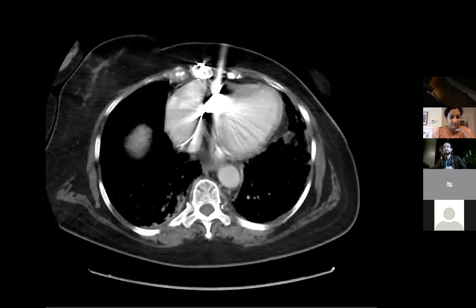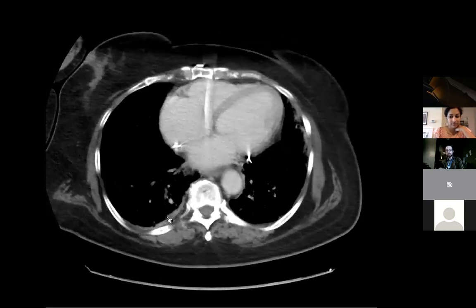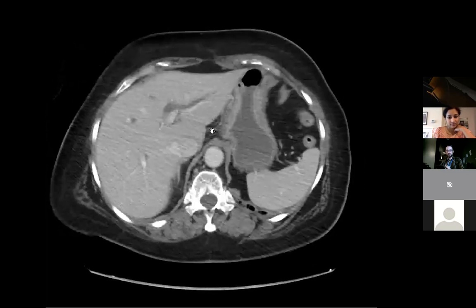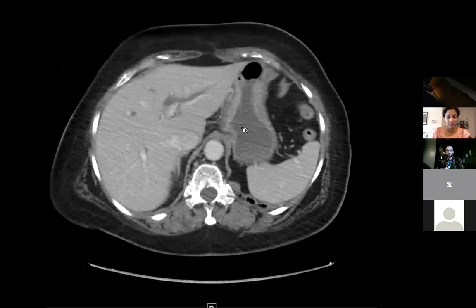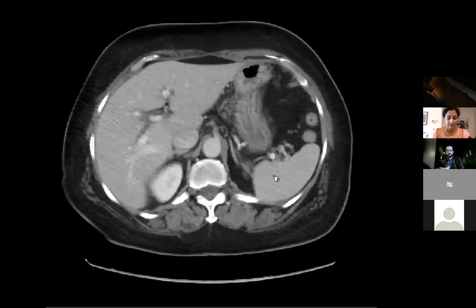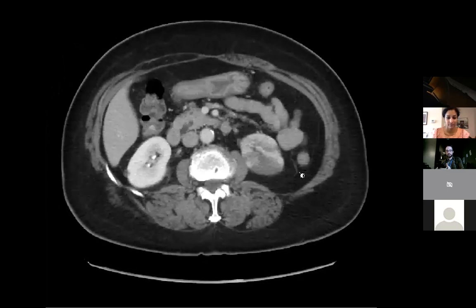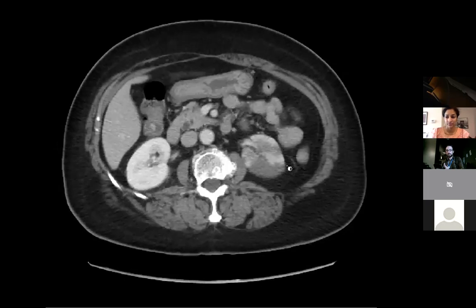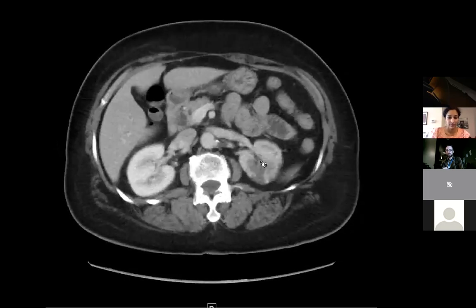So this patient was not known to be positive. She just came in with several days of abdominal pain. So she had absolutely no symptoms related to coughing or anything like that. So no classic symptoms. She just came in with abdominal pain. As we move through her abdomen, you can see very clearly these large areas of hypoenhancement. So our initial thought, of course, jumps to pyelonephritis versus infarcts. My thought was it's an infarct because they're so sharply demarcated, although obviously you can't always tell them apart.